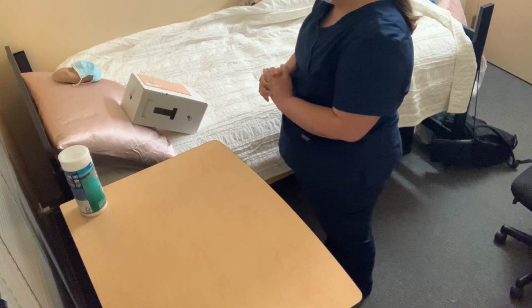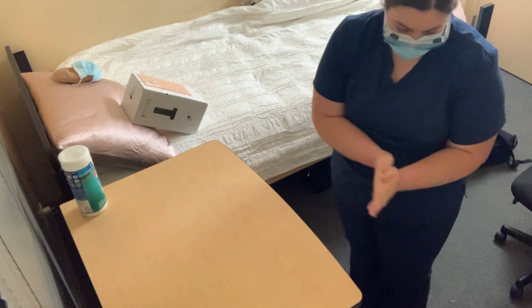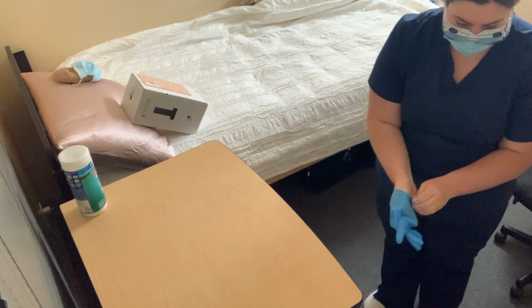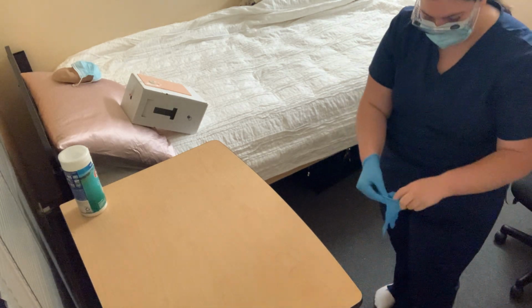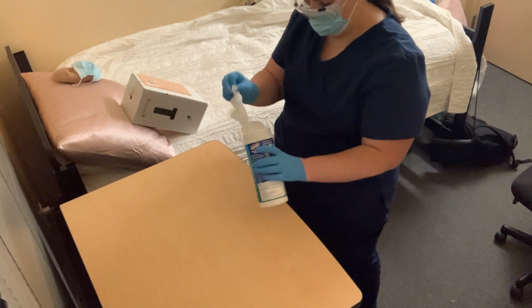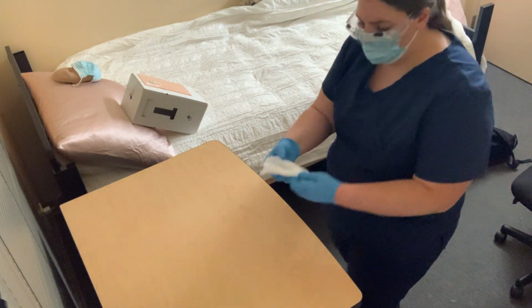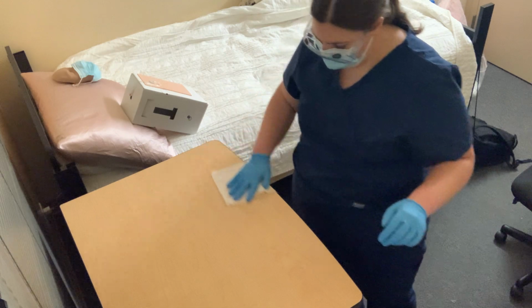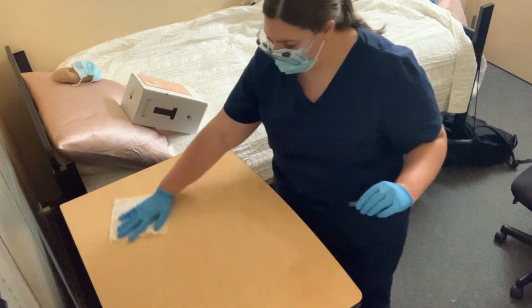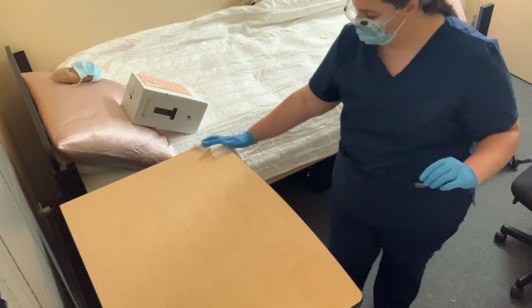And I'm going to go ahead and get started on prepping my workspace. So I'm going to do more hand hygiene. I'm going to put on a pair of gloves. I'm going to take a Clorox wipe and wipe down my table, making sure to cover the table completely for 30 seconds. I'm also going to get the edges around the table.